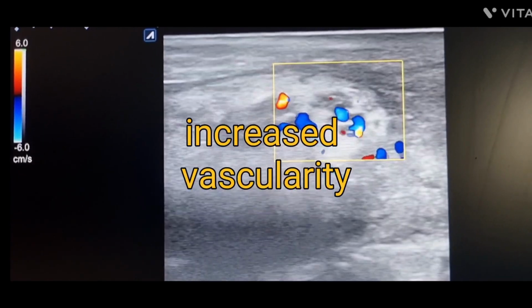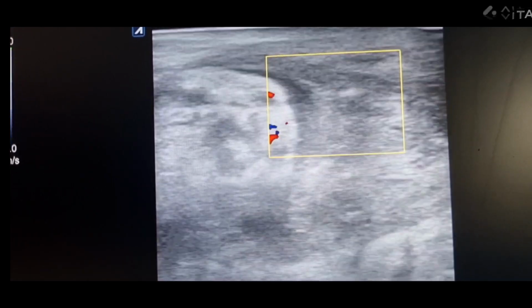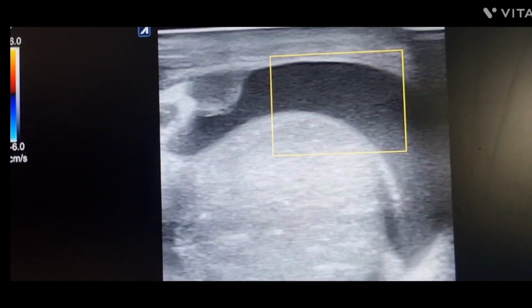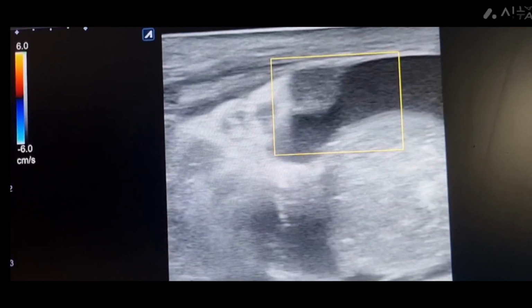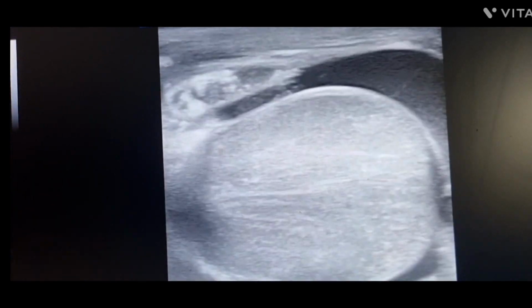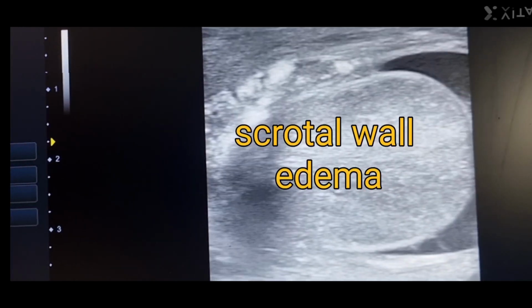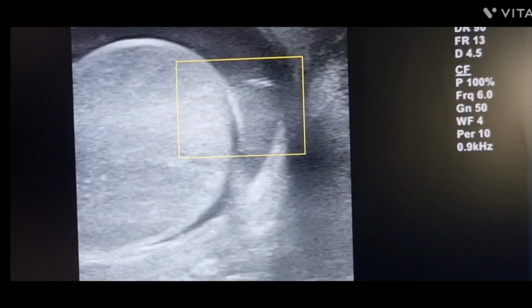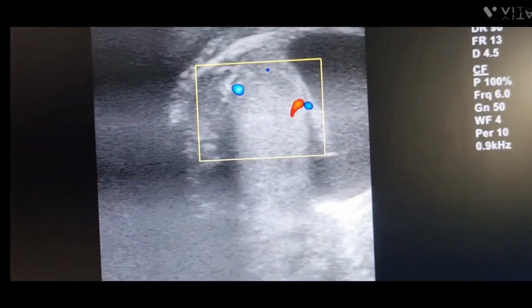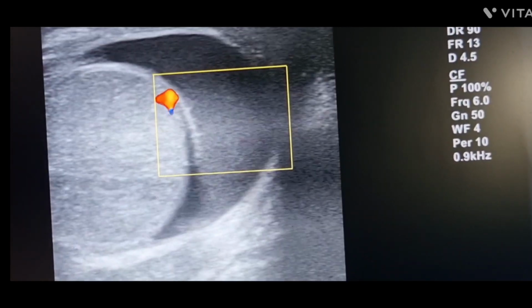On clinical examination, we see scrotal skin is warm, erythematous and mild swelling is present. And on scrotal elevation, he gets relief in pain. Always remember, if you get the time, there is no harm in examining the patient clinically because it will help us to reach close to the diagnosis more firmly. So, on the basis of patient symptoms, we decide to do scrotal ultrasound.